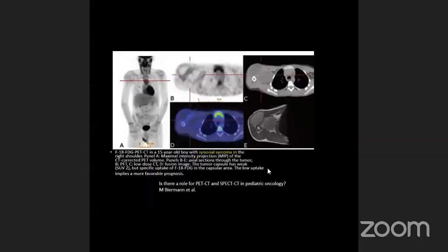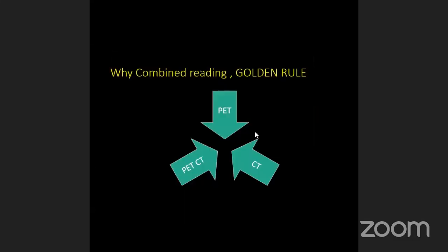Some of the tumors we just mentioned can be negative in PET, but still malignant. It is still, for example, synovial sarcoma. Some types of mucinous tumors as well. So take care, not everything that doesn't show uptake in the PET is benign. You think that it is benign, and it is not. This is the beauty of hybrid imaging, that you have to take the benefit of all the modalities you have, not just a single modality.